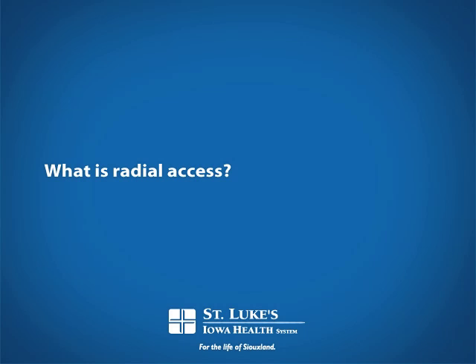Can you explain what radial access is? Sure. Radial access is just another way to approach the heart utilizing a different vessel. Traditionally, we've used the femoral arteries to gain access to the heart. The radial artery in the wrist is just another way to be able to gain access. It had not been used as frequently in the past, but is another option to safely access patients.